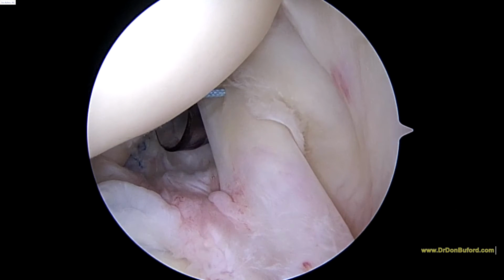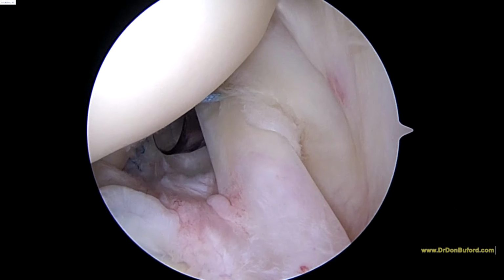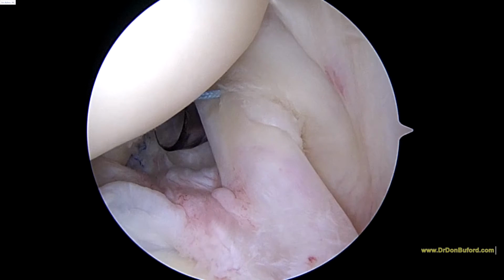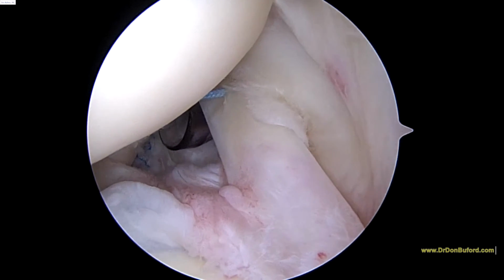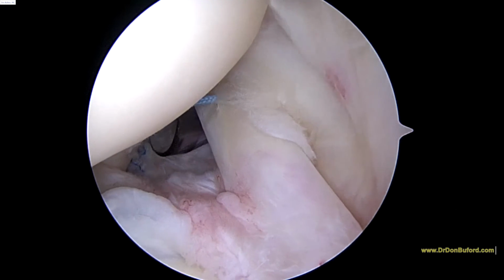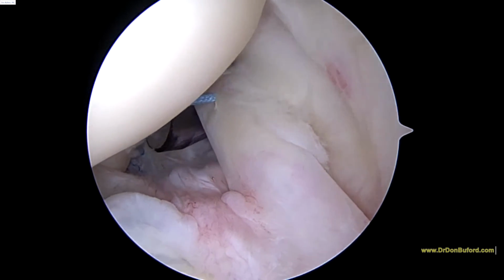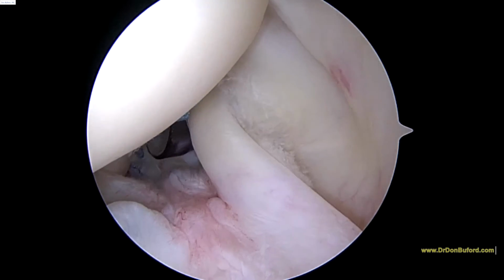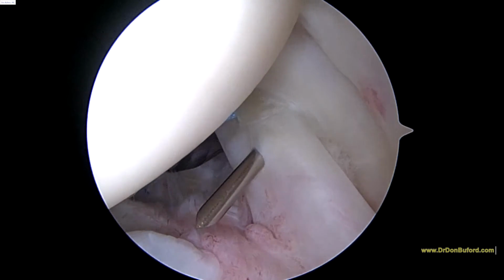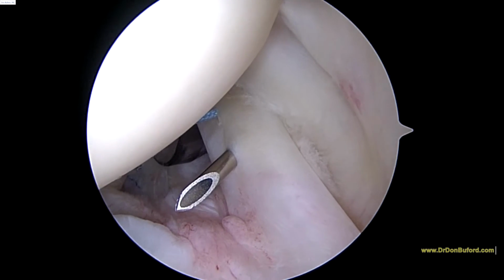So pull back, you can see how that goes through. And now we're going to take that spinal needle and do it one more time. Essentially in the middle. It's not a bad spot there. We'll feed that relay through again and show you some more in a minute.